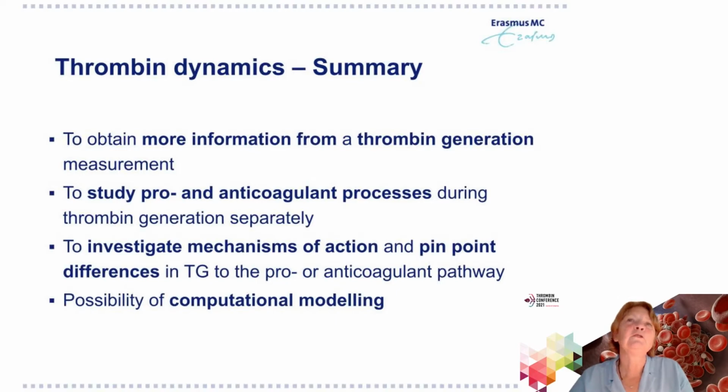So in summary for the thrombin dynamics, we can get much more information from a thrombin generation measurement. We can study pro and anticoagulant processes during thrombin generation separately, and we can investigate mechanisms of action and pinpoint differences in thrombin generation to the two pathways. And the last few examples I showed you are some possibilities of computational modeling.